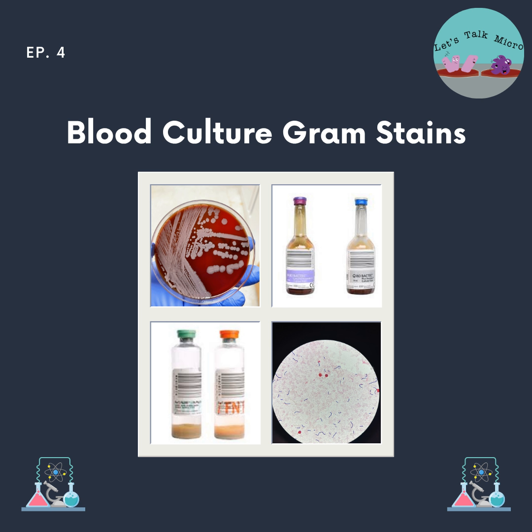We have to make sure that we're thorough, and if something is there, we find it. And lastly, we went over critical values that are of clinical significance and very important, and we have to report them as soon as we find them. As soon as we obtain these values, we have to report them.